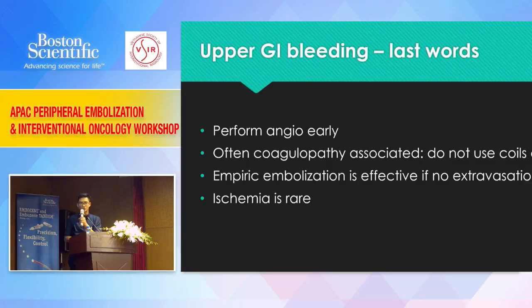And we have to correct the anticoagulation, because the patient often has associated coagulopathy. In that case we don't use only coil. Coil is not enough.